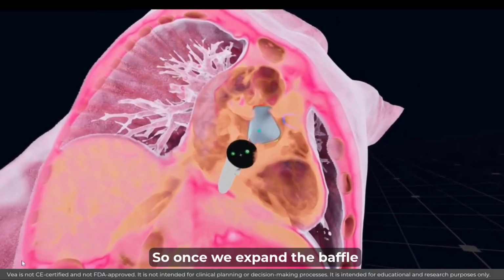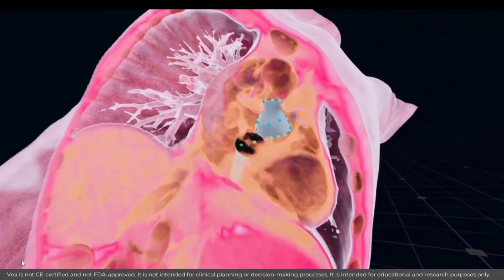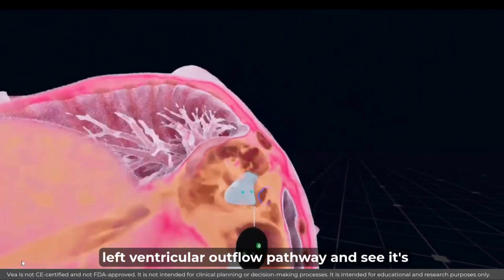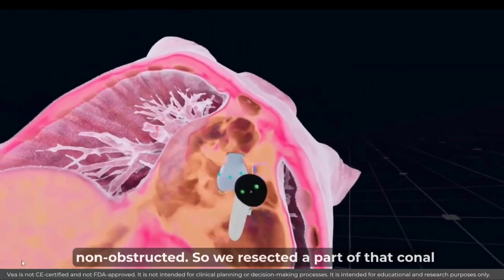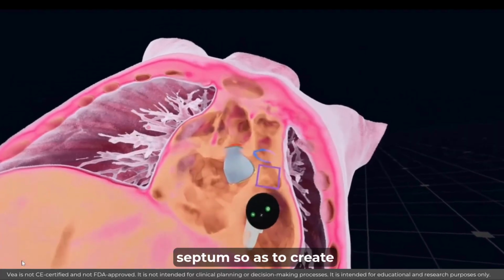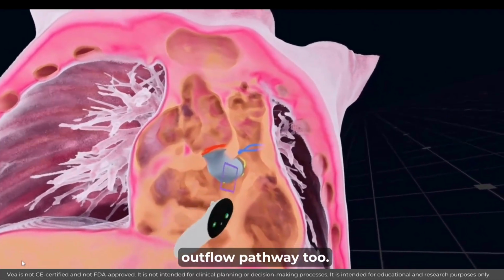So once we expand the baffle to make it non-obstructive, you can have a look at the left ventricular outflow pathway and see it's non-obstructed. So we resected a part of that conal septum so as to create an unobstructed right ventricular outflow pathway too.